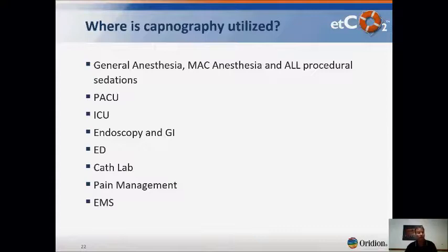so the sedation works. But when they're done with that, they might leave the patient staying in that chair or bed or gurney, and now they're not being stimulated, and the sedation they gave earlier can take hold and end up resulting in them stopping breathing. So in the emergency department, whenever they're setting a bone or a dislocated shoulder or anything painful, they'll give sedation, and now they should be monitoring capnography, because once again, when they stop that stimulation, the patient could go into a point where they quit breathing.